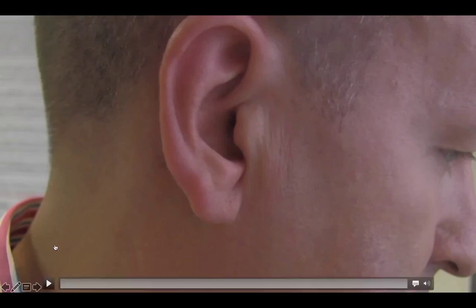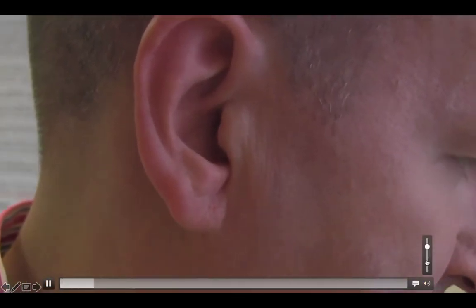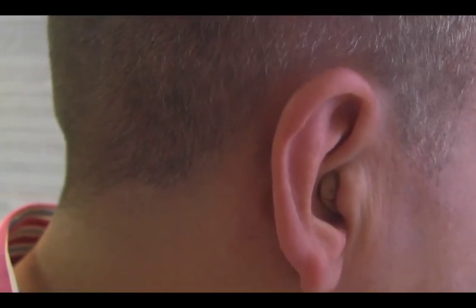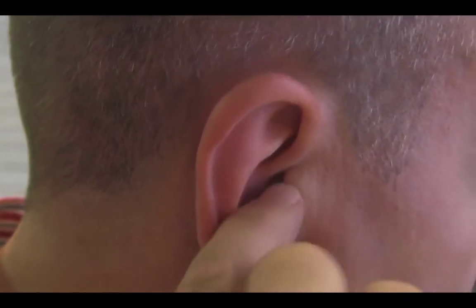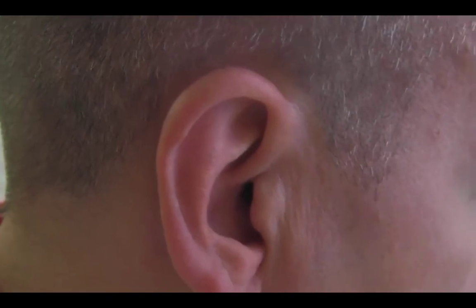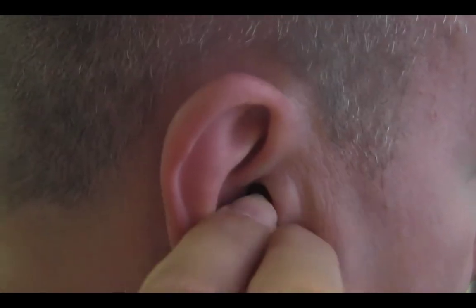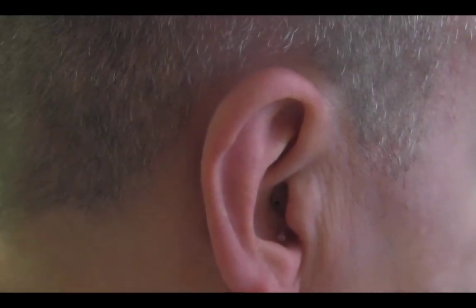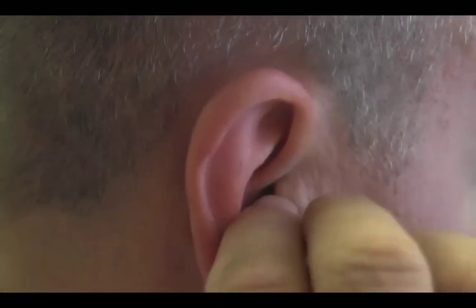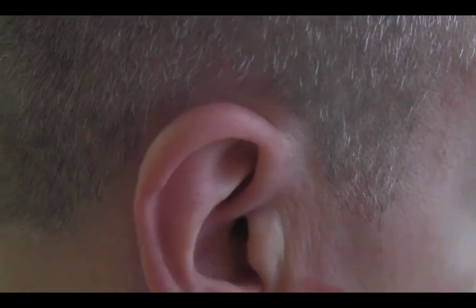This is how this hearing aid is. This is a CIC. Goes in there. Just visible from the outside. Just visible from the outside, the CIC hearing aid. And another type which is invisible in the canal or nano. Goes in a little bit deeper, a little bit harder to see, if not impossible. Little cord to pull. Like he said, a little bit deeper and a little bit harder to see. There we go.